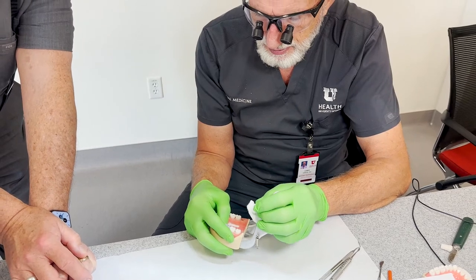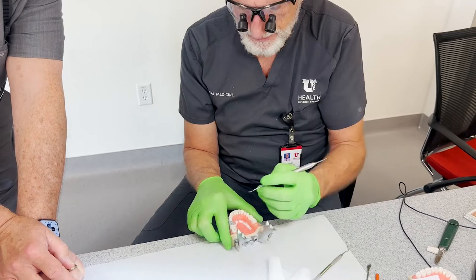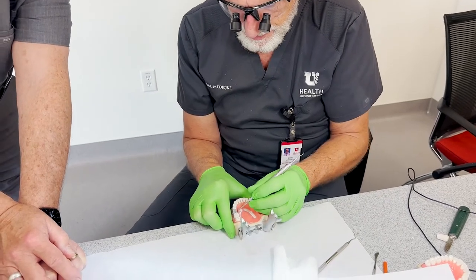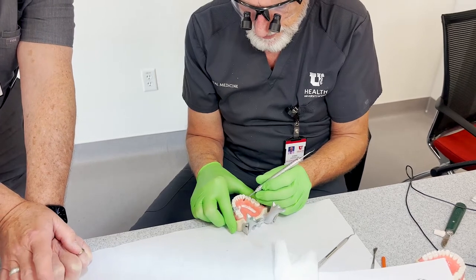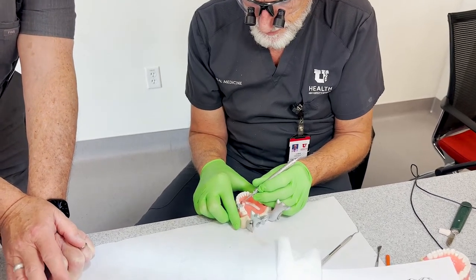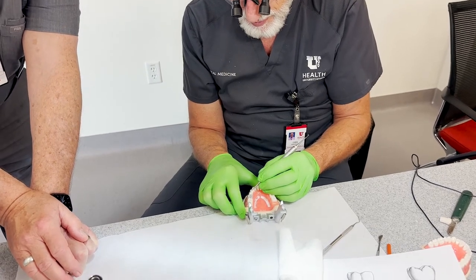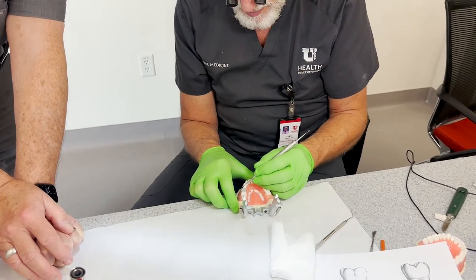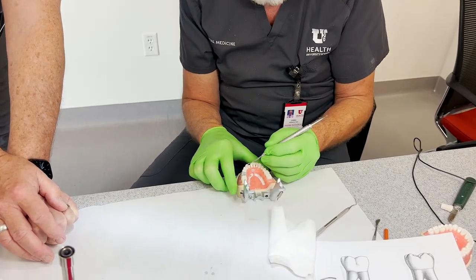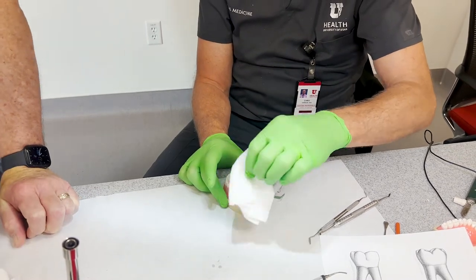The other thing they told me was they still are casting metal, and they do the wax up then. So at least for this group, as they go forward, they'll still do the wax up. Okay. But that's an impressive wax up. I think they were able to see how nicely it can be done. Pretty quick. You love it, though. I do like it. It's fun.